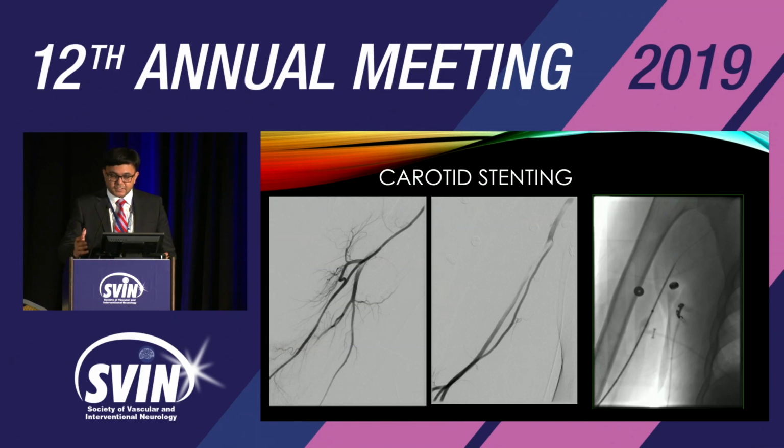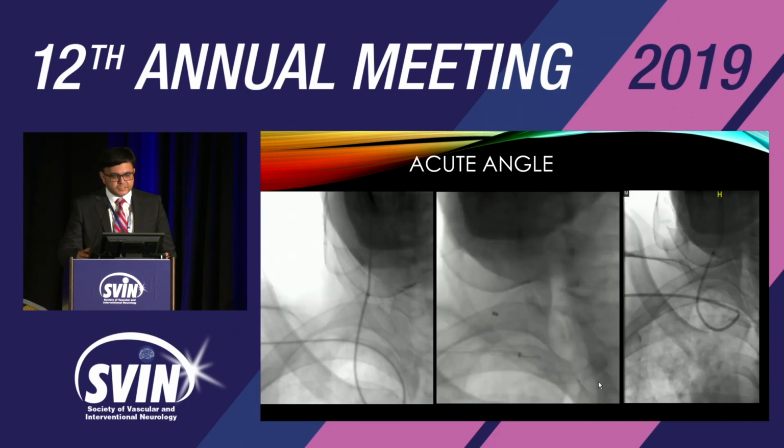So I was a little bit nervous, and we do them with moderate sedation. We don't intubate this patient. So we said, fine, let's try it. What's going to happen? If it doesn't work, I will put a TR band and I will puncture the femoral artery. We put, again, our Infinity with the introducer wire. You can see it took the path of the right common directly. This is our Infinity into the mid common artery.